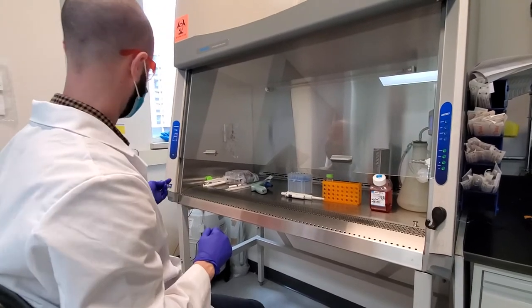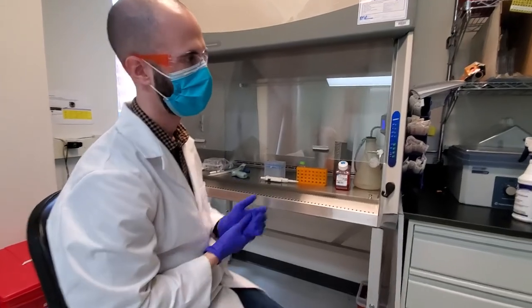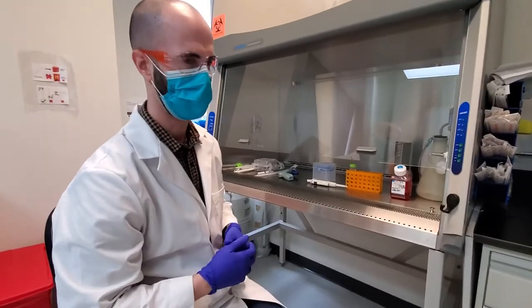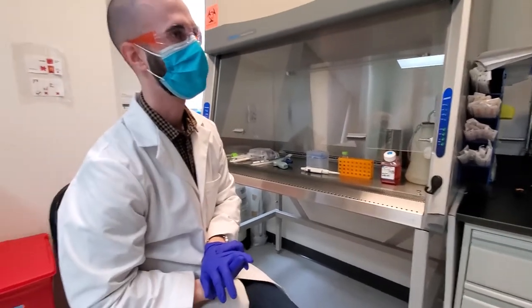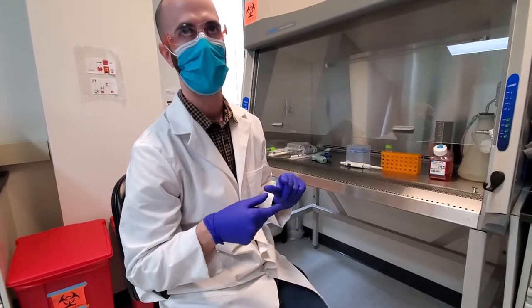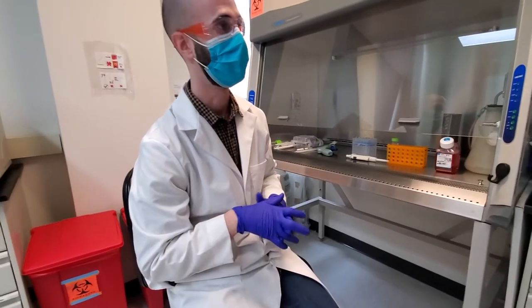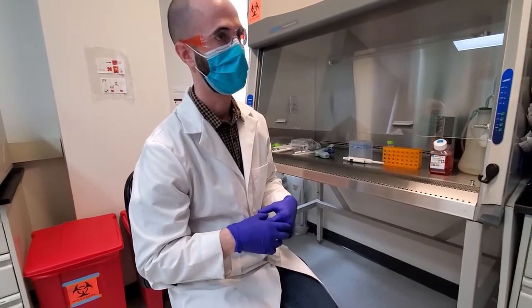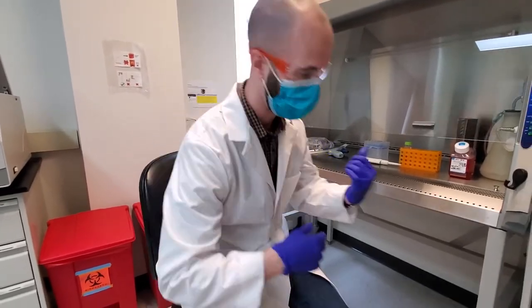Now I'm going to go in and grab the cells from the freezer and then start thawing them right away. There's a couple different ways you can thaw them. You can put them into the bead warmer. That's pretty slow. I like to thaw under running water and turn it on to heat it up. The only downside is that if there's not a good seal on the cryo vial, theoretically you could get tap water in there, and that's bad. Cells are going to burst and they'll be contaminated. I haven't had that problem, and I'd rather just get them thawed quicker than slower. So I do that, and then I just spray it down really well and move it in.